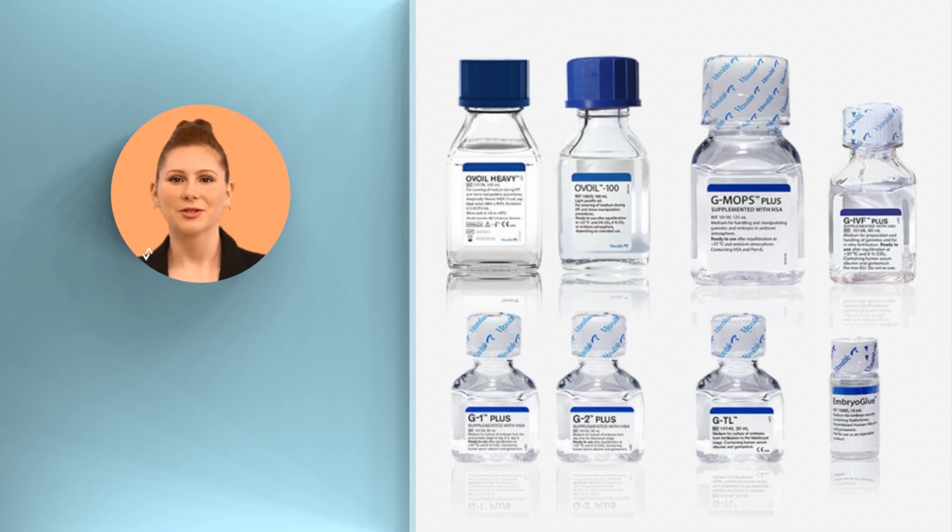The media used in culture systems varies widely and can include sperm preparation, handling, and freezing media, oocyte retrieval media supplemented with protein, and occasionally heparin, embryo fertilization, cleavage and blastocyst stage culture media, and vitrification and thawing media. Lastly, light or heavy oil, and wash buffers that are used to rinse plasticware, pipettes, and oil, for vaginal and cervical washes, and to wash biopsy trophectoderm cells.